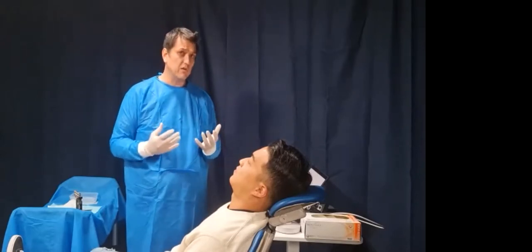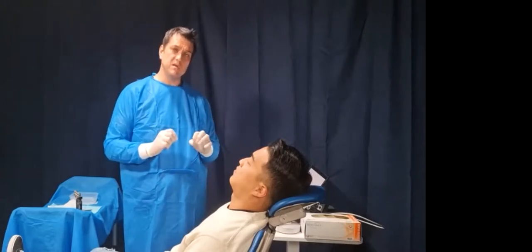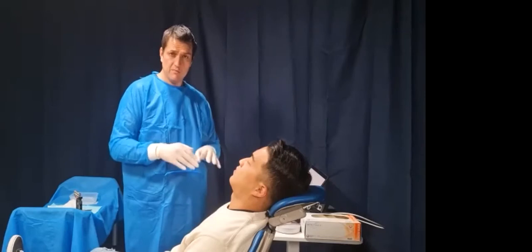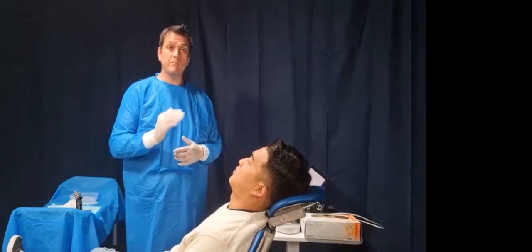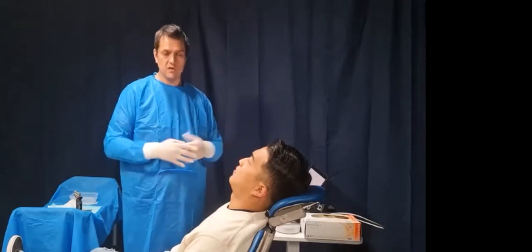And that's the reason you get a lot of issues posteriorly. So if you can actually build your splint for the patient in the mouth, and then record that digitally, you're going to see, as I did with 300 cases, bang, perfect occlusal, nice occlusal contacts.